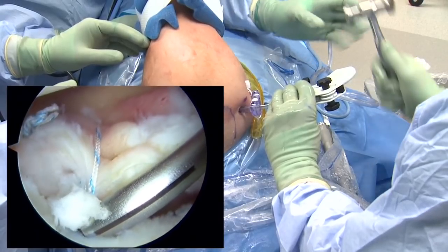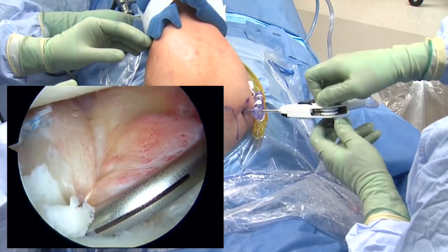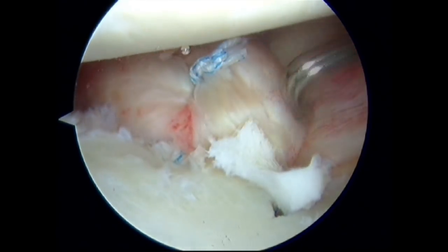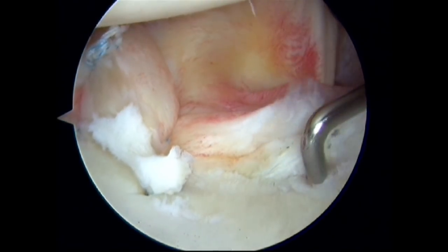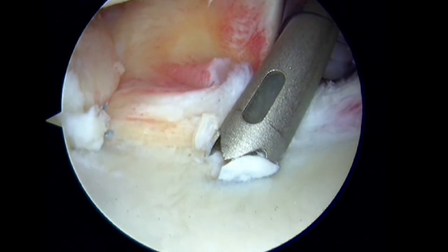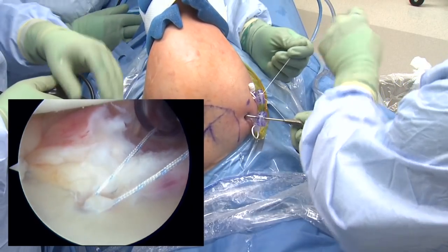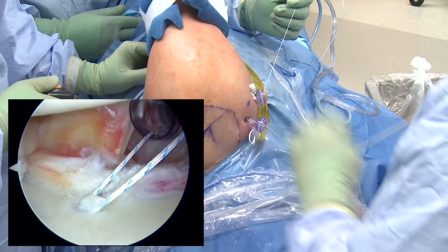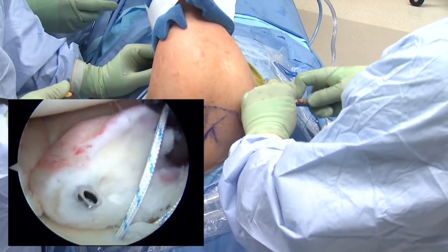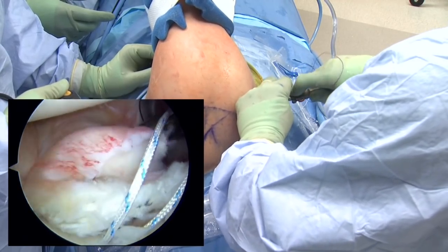The next and final method — my favorite — is a simple suture with a suture shuttling technique. I usually do this three times: three anchors in a simple fashion, which is the simplest way of doing a Bankart repair. We can see a little tissue left at the top, so we have two anchors in and we'll put a third anchor in here, pass our suture through and shuttle it in a simple fashion. The anchor goes in, we tap it down, and again go through the process of securing one suture so when we pull it doesn't slide together but independently. We then come in with a lasso, spectrum, or similar instrument to pass our suture — this time through capsule and then also through some labrum, a double pass, which is often very helpful.